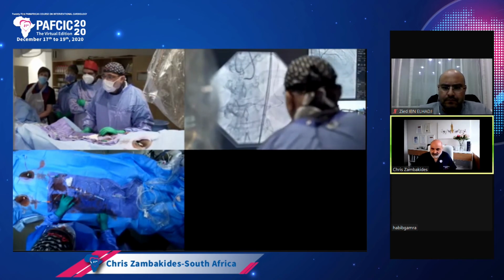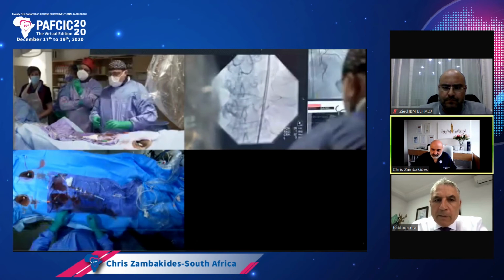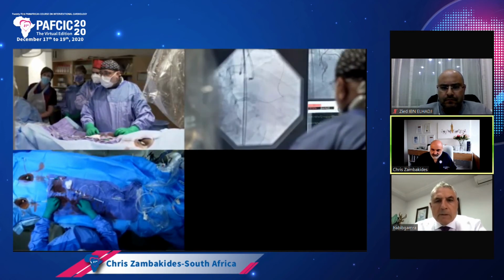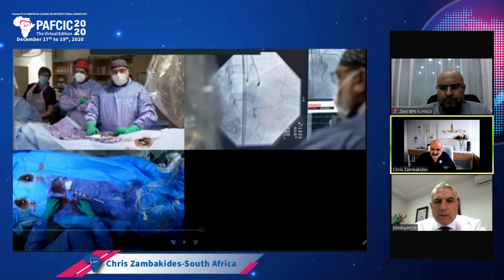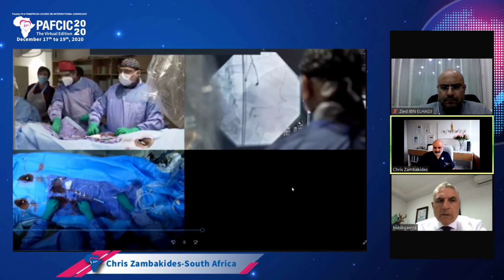Okay, so definitely there's stent on top and stent at the bottom. Whether you went out in that... no, it's a knuckle. I don't think so. I mean, this one looks in, can you see there? Yes. Okay, that looks good. Okay, so go back to the LAO cranial.